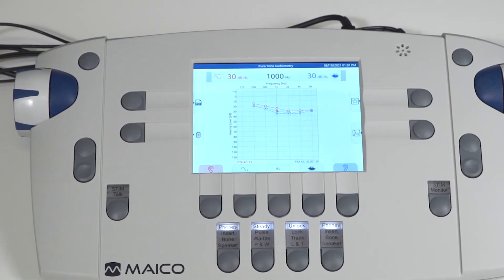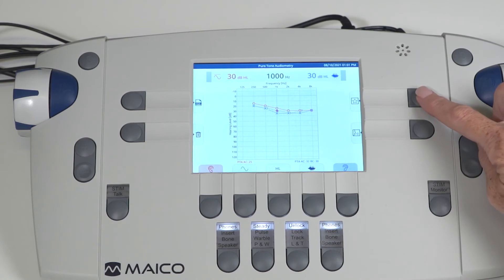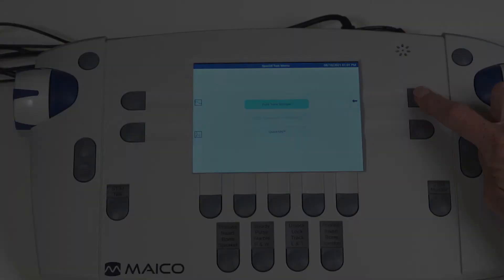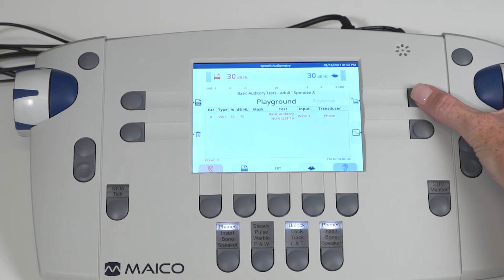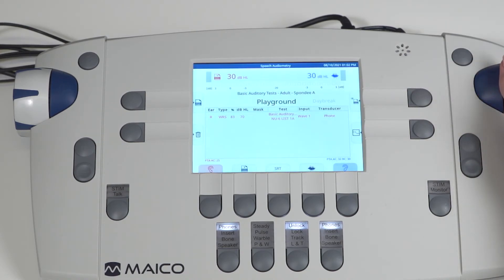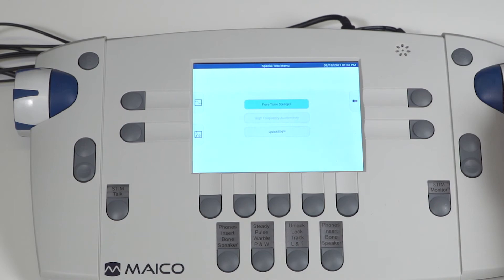When you see the icon with a star in the box, a quick select will open the special test screen. When this icon is not displayed on the test screen, an advanced select will open the menu for access.